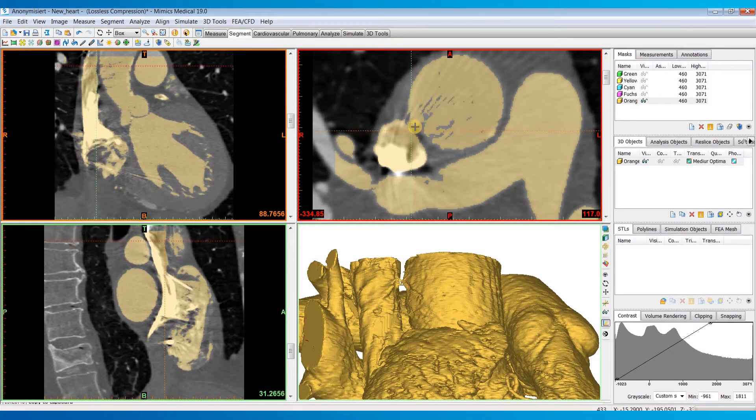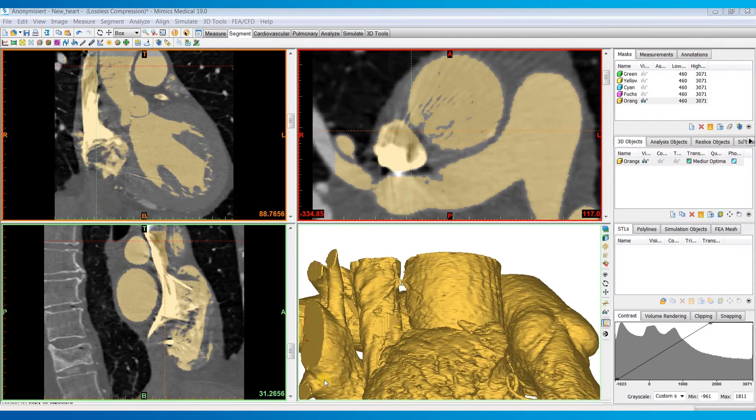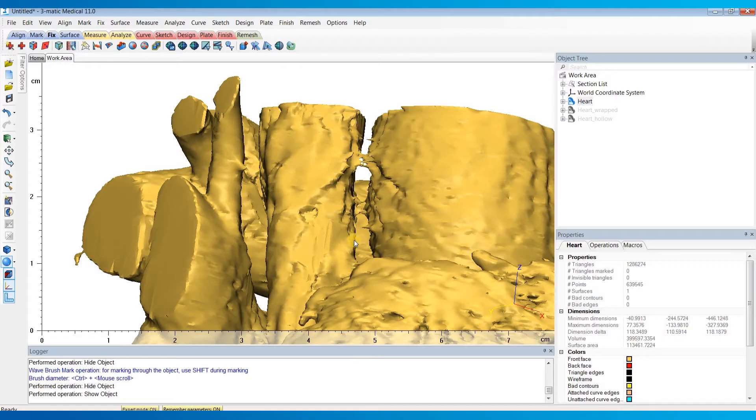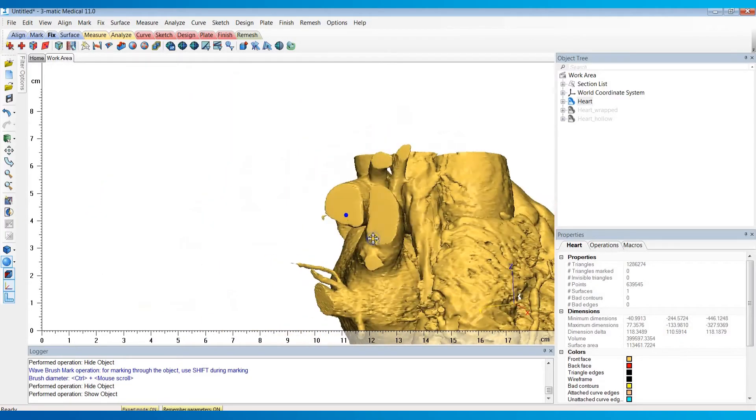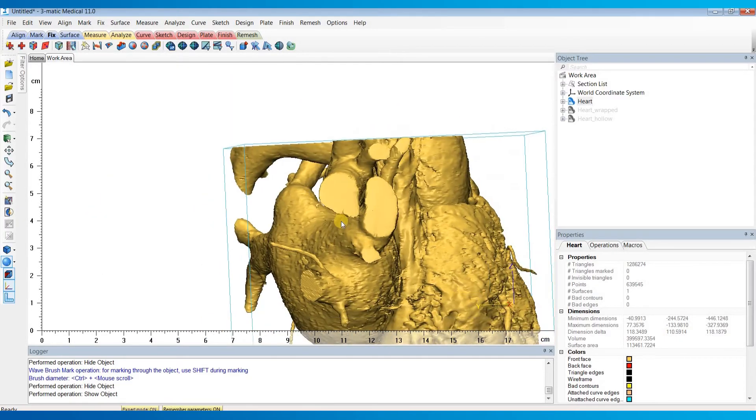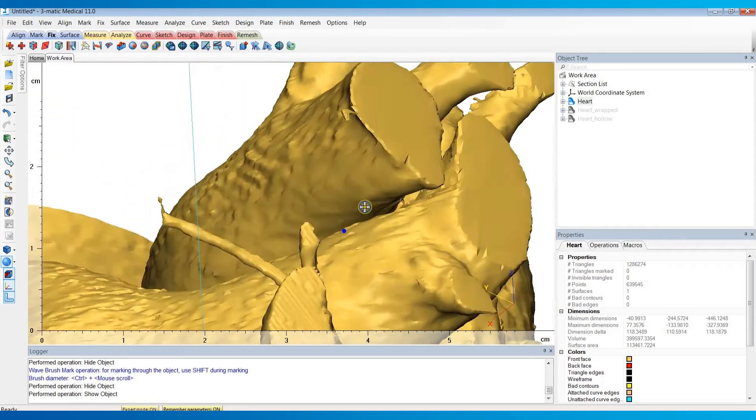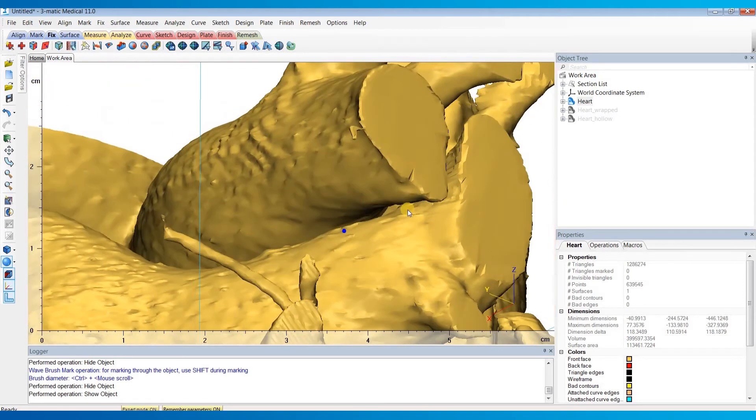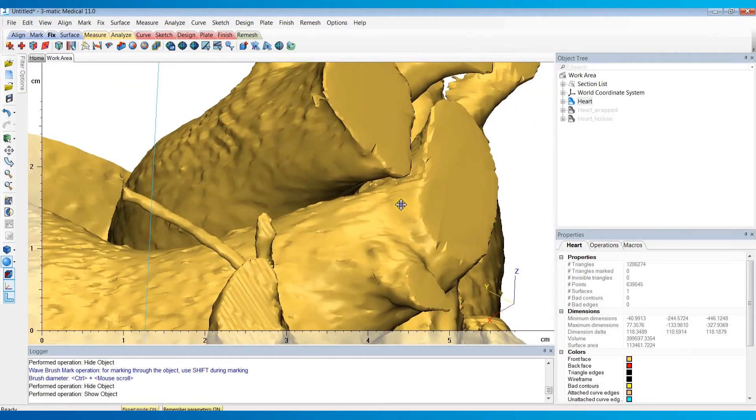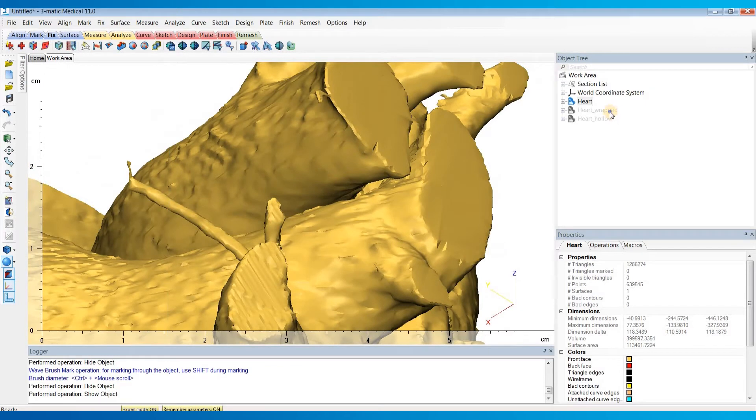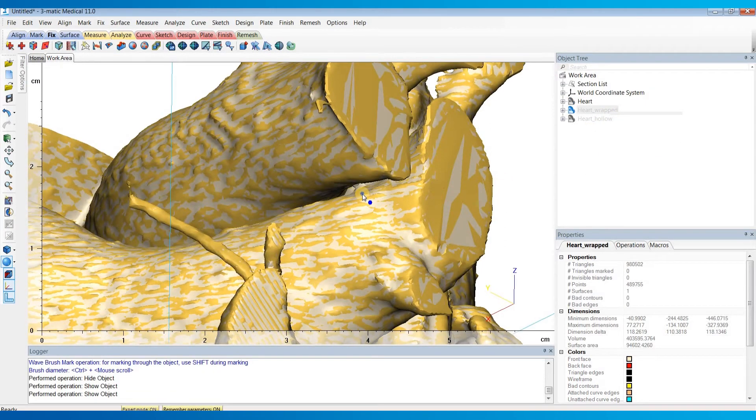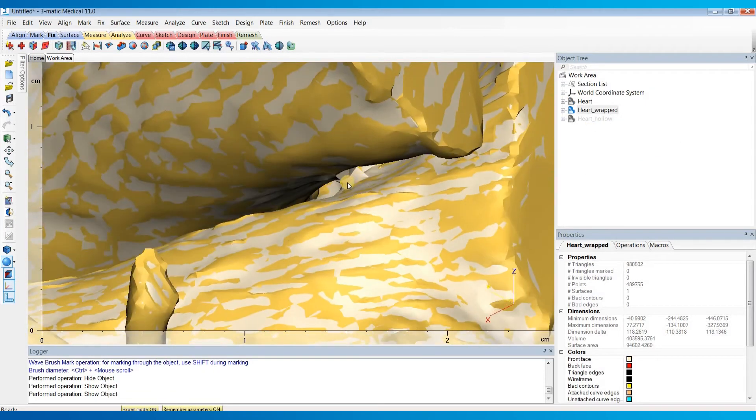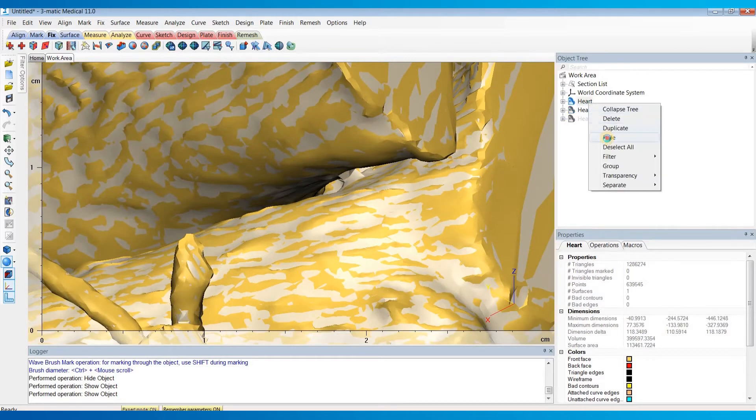The second and less obvious thing that can cause these holes is the wrap operation. If we go back to 3MATIC, and if we look at our 3D model prior to the wrap operation, you'll see that there's no connection between this pulmonary artery and pulmonary vein. But then if I turn on the wrapped model, you'll see that there is now a connection that exists between there.